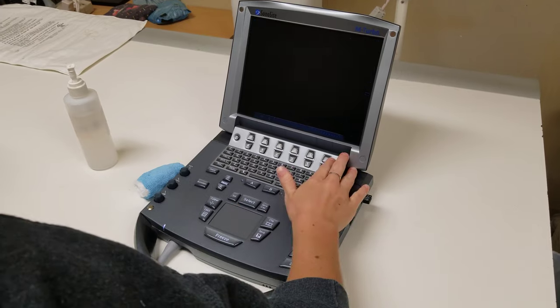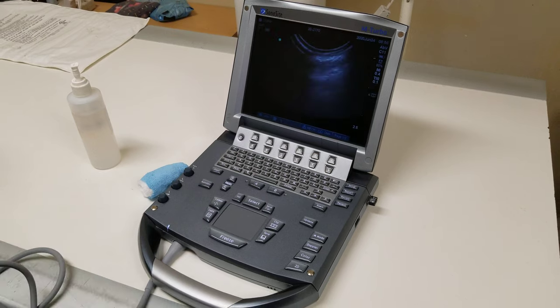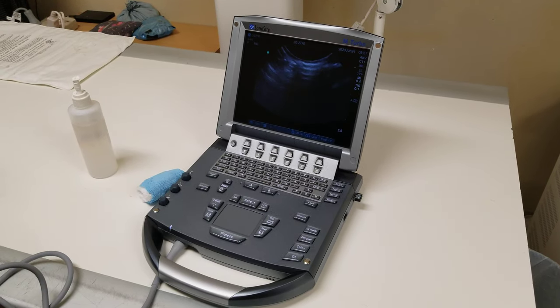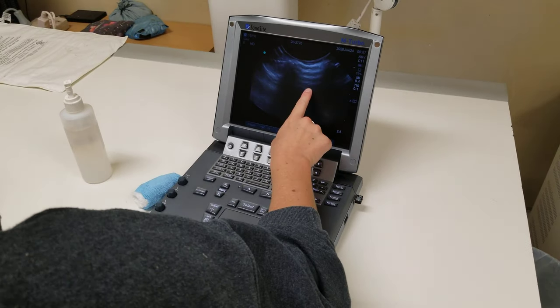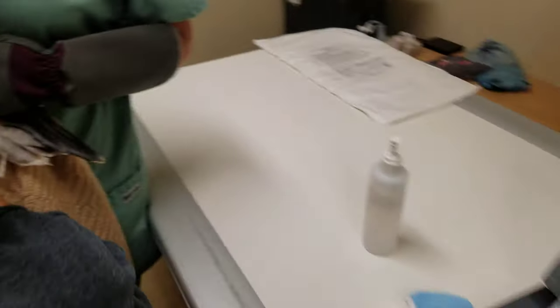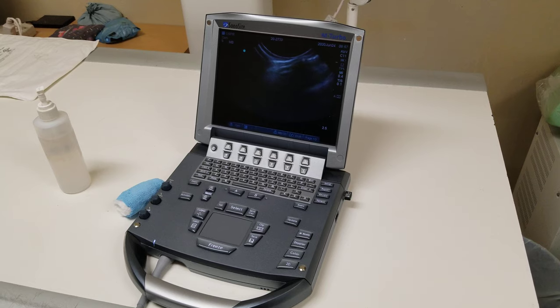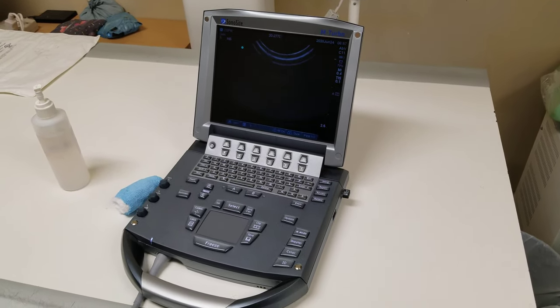I'm going to scan this one more time — there's my rib space right there — clip and save. Then I'm going to go down to the next rib space, find my A lines and my gator sign, scan ventrally till I lose it, scan back dorsally, clip and save. Then the third intercostal space: find the gator sign, scan ventrally till we lose it, scan dorsally, clip, save — and that's it, all done.